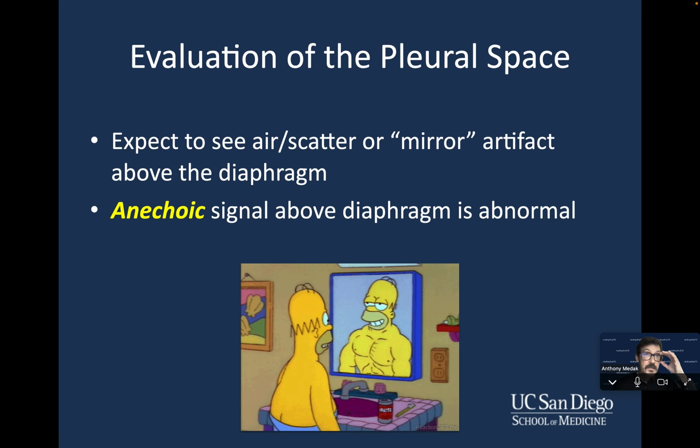Now, one thing that's very important when you're focusing attention and trying to look at the lung with ultrasound is that, for those of you that I've worked with in small groups, you've heard me say before that ultrasound has 2 main enemies, bone and air. And so when you're trying to look at the lungs, which are surrounded by ribs, bones, and are 2 giant bags of air, you can imagine doing ultrasound can be challenging.